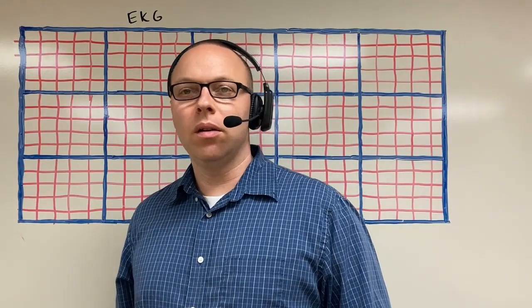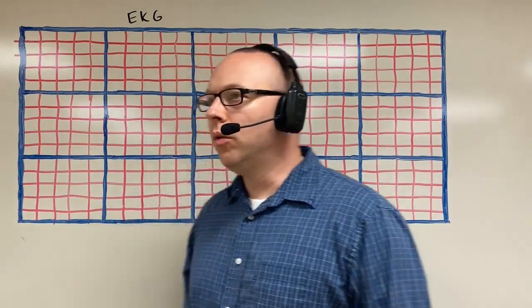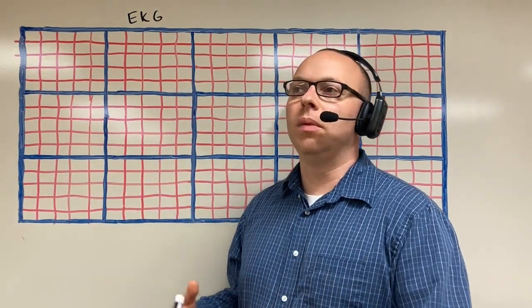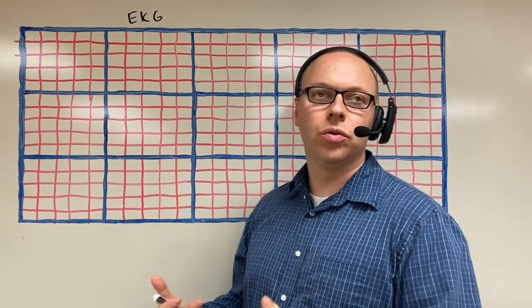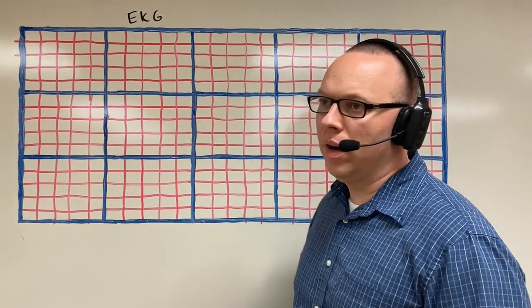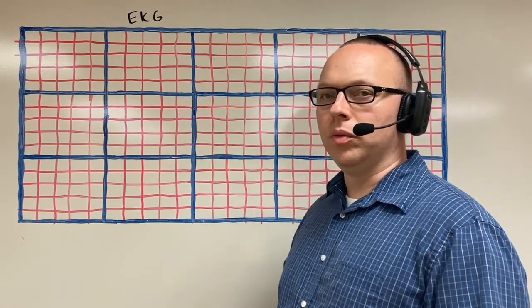Alright guys, we're going to be talking about EKG today. So this stands for electrocardiogram. This is going to basically record the electrical activity of the heart. We're going to start off with the basics and kind of work our way up. Let's talk about the waves we're dealing with first.